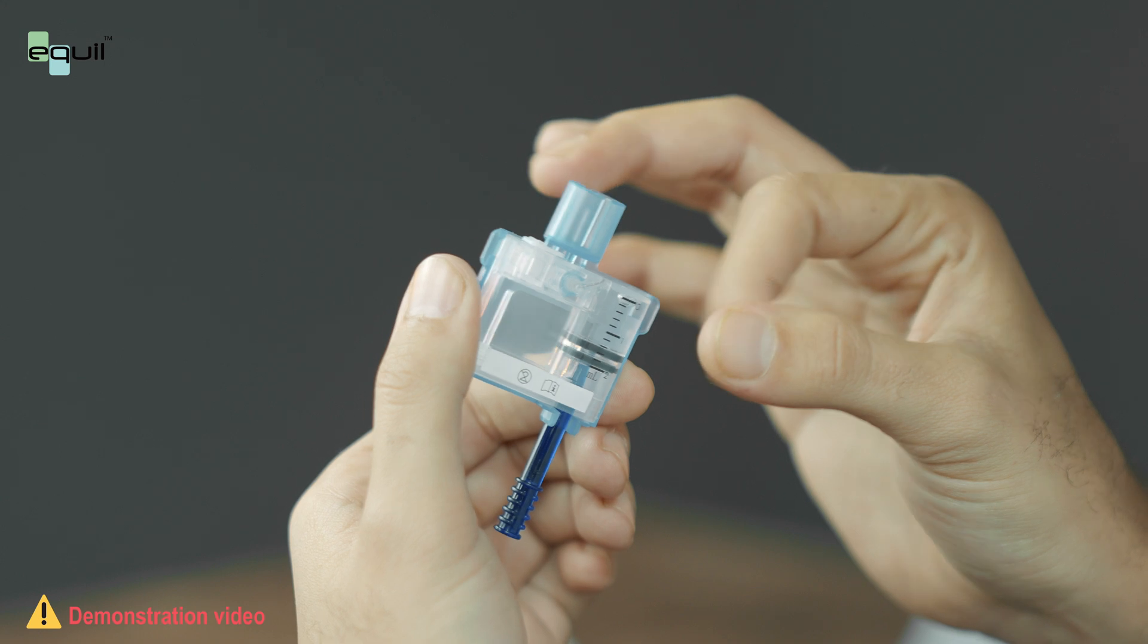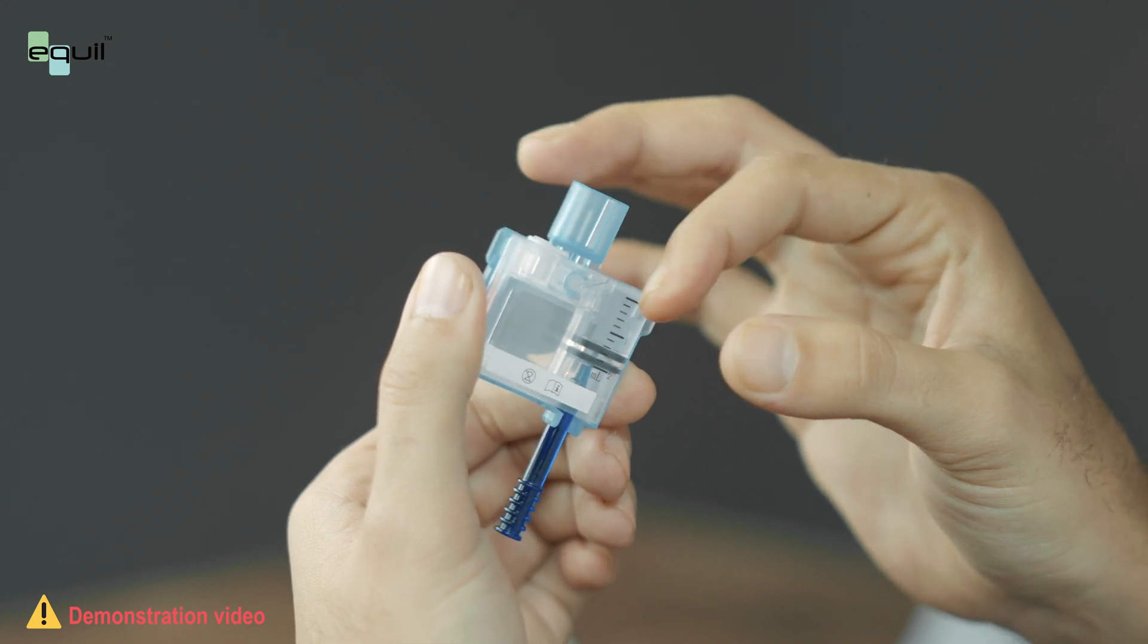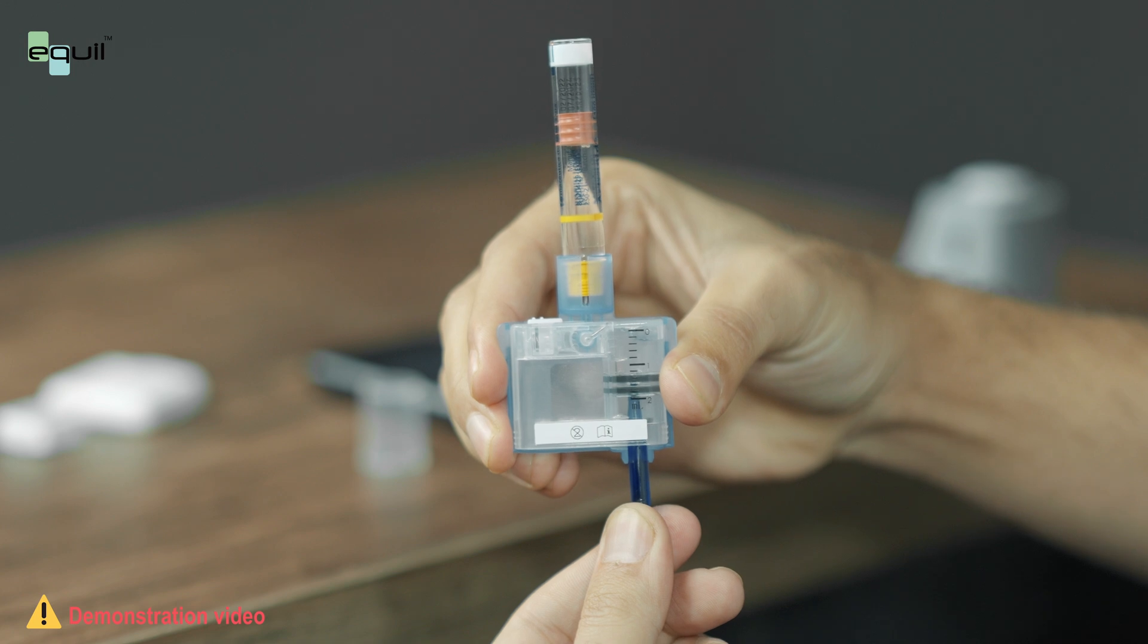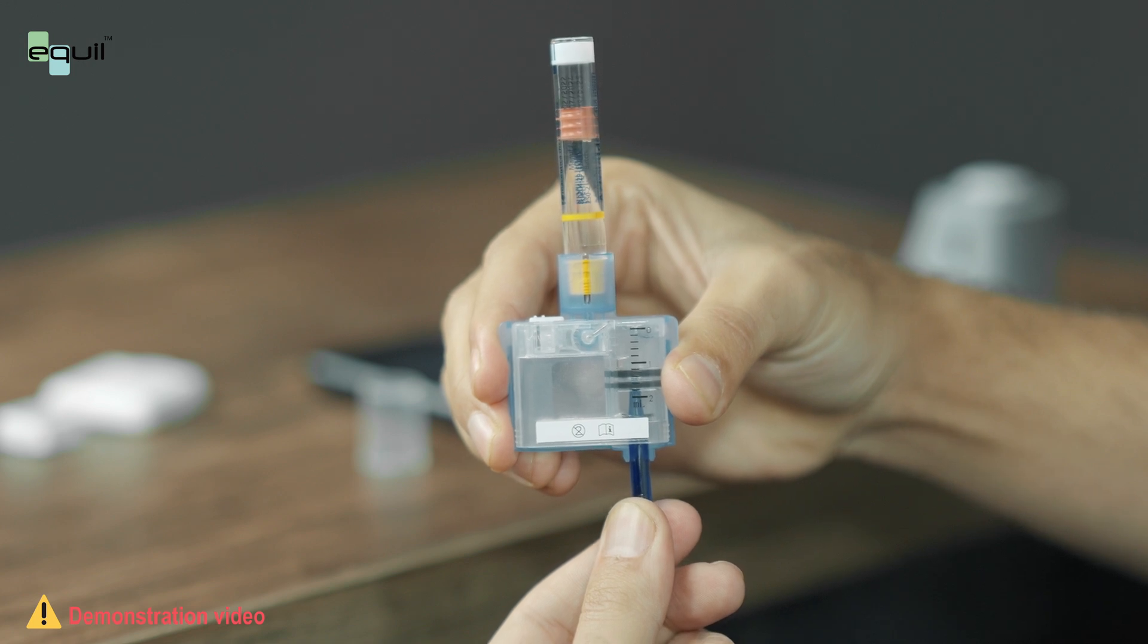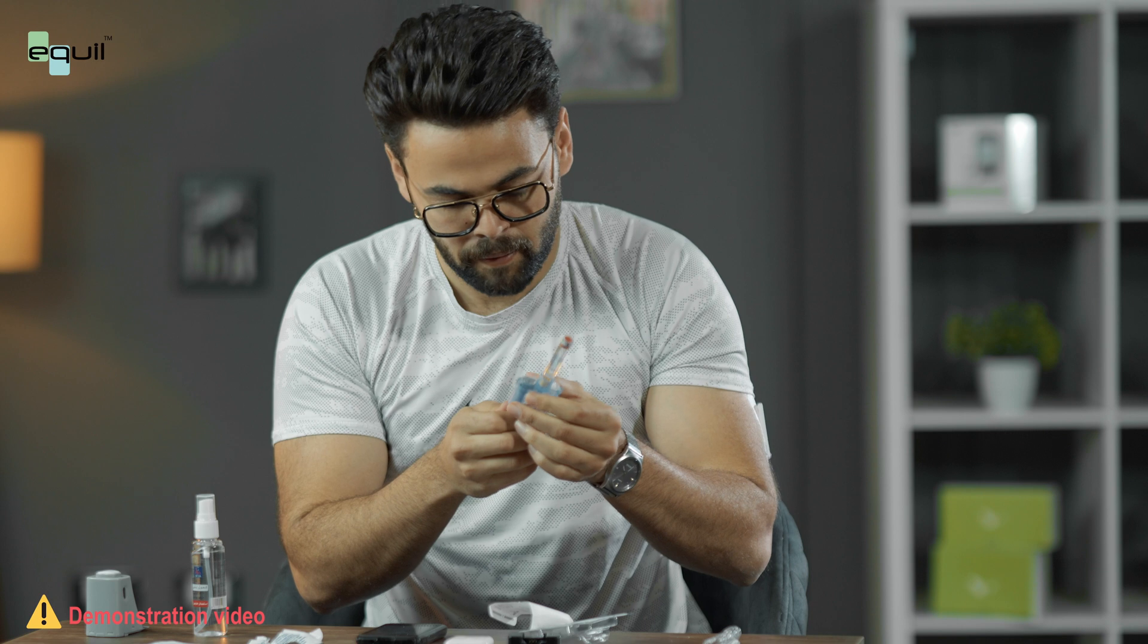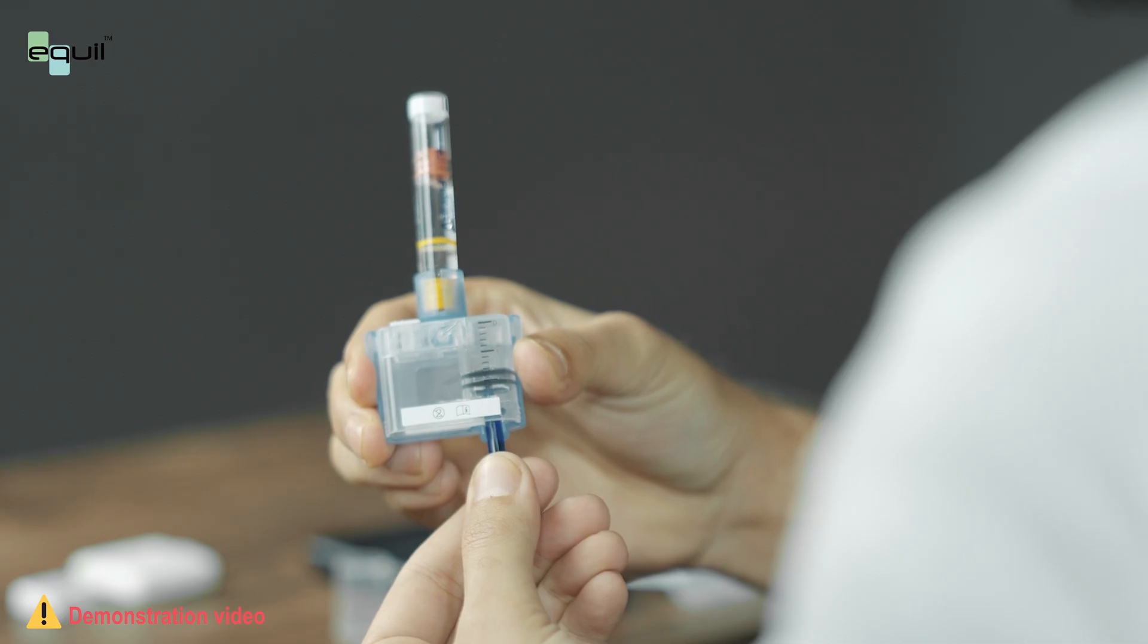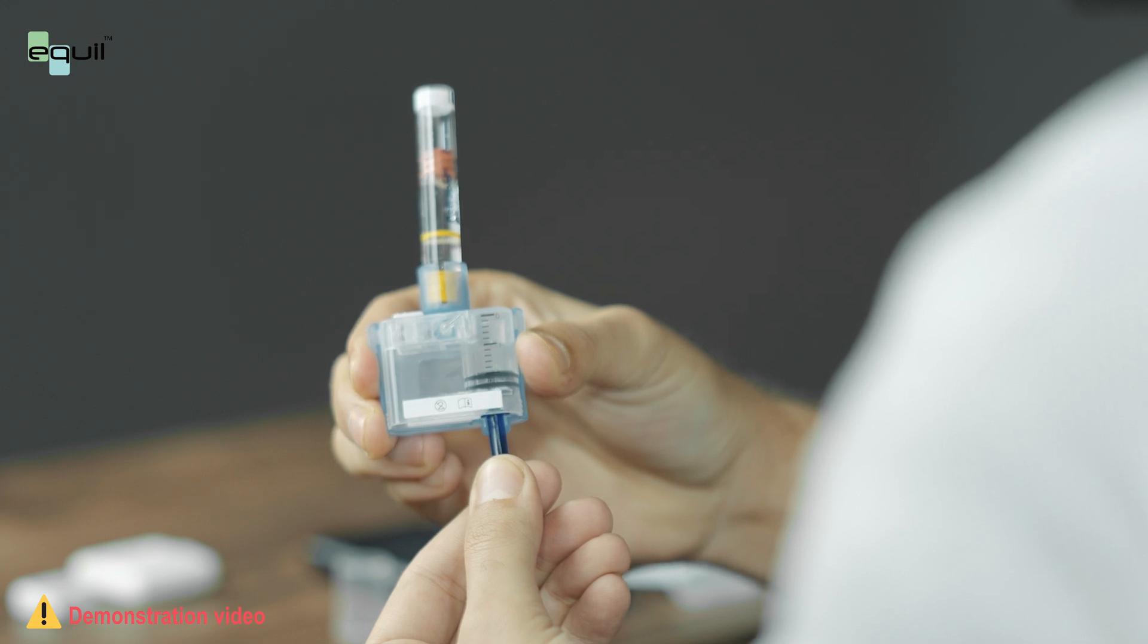Gently tap the side of the reservoir to encourage any air bubbles to move to the top of the reservoir. Push the pull rod slowly to eject the bubbles back into the cartridge. And then slowly pull to draw more insulin into the reservoir. Repeat until the reservoir has enough insulin and there are no visible air bubbles.